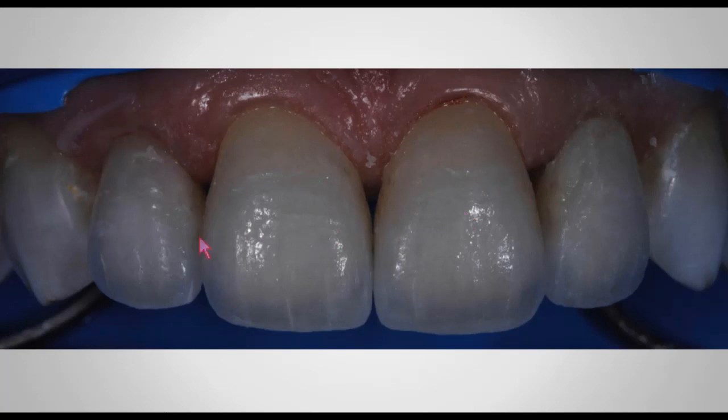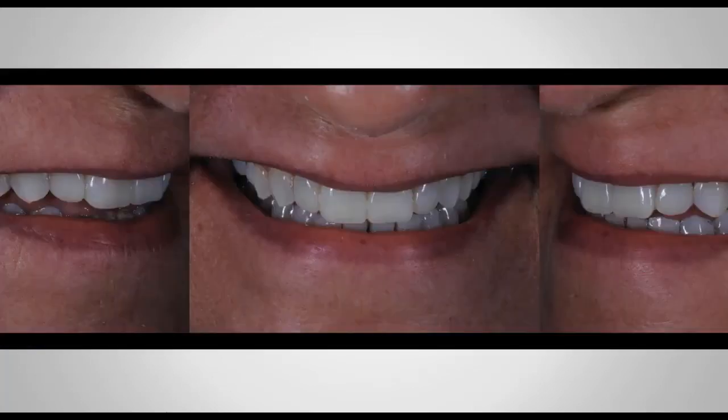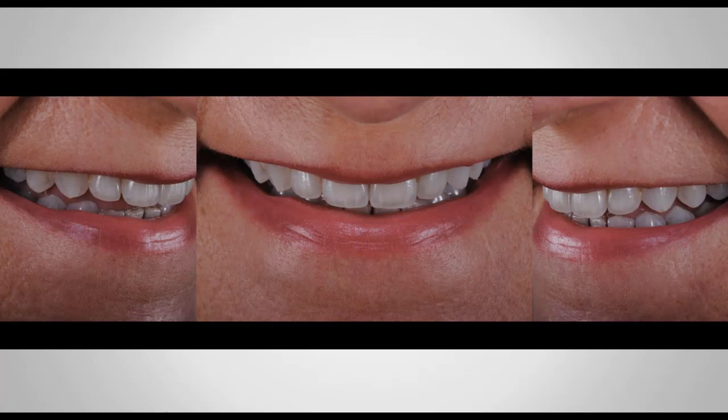And here you go, you have all my 4 porcelain veneers bonded to the surface of the teeth, and you can see all the intrinsic characteristics that my lab tech was able to get into these veneers. Wonderful job by his wonderfully crafted and gifted hands. And you can see here, these are the temporaries, and I'm just going to show you the before and after. This is actually not immediately after. This is 30 days after all 4 veneers were bonded.